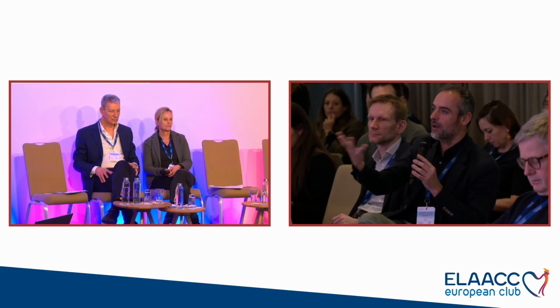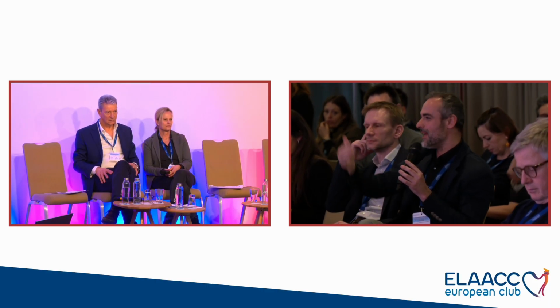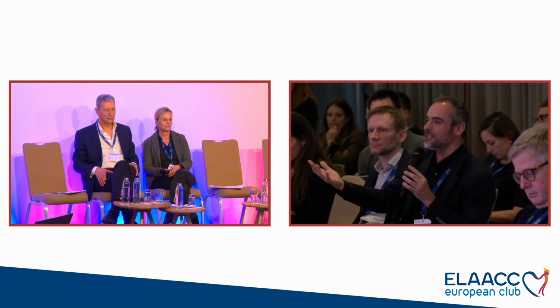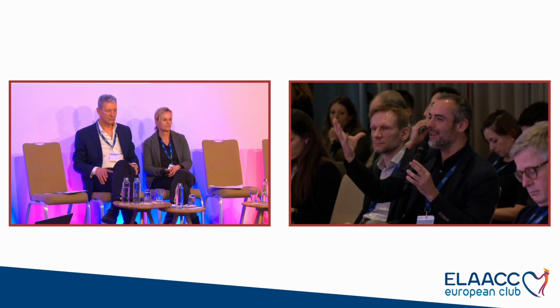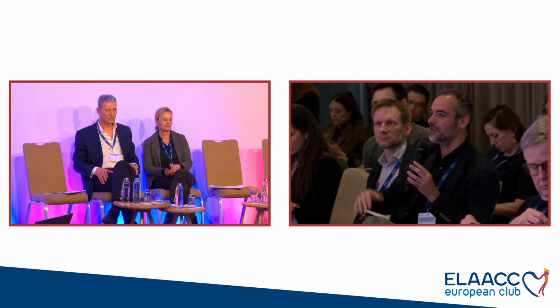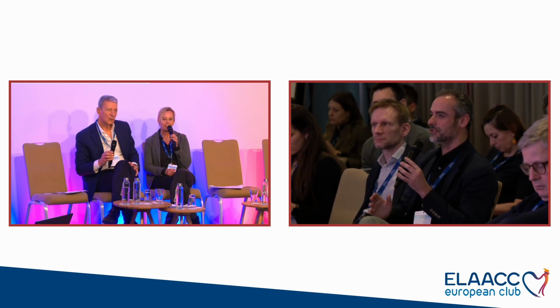I think that it depends on each center's availability. It's like CT. For us, cost matters, and then we have a good echocardiographer, so mini TE works very well. Maybe in another center it's the opposite: cost maybe doesn't matter, and they don't have a good echocardiographer. So it's probably ruled by other factors, and you cannot do a side-by-side comparison, because it's not applicable just to countries or others. I think this is very reasonable.